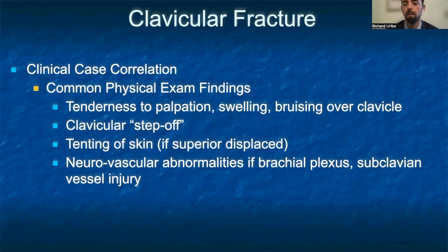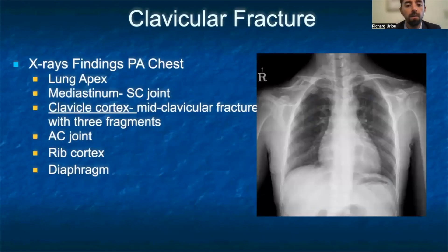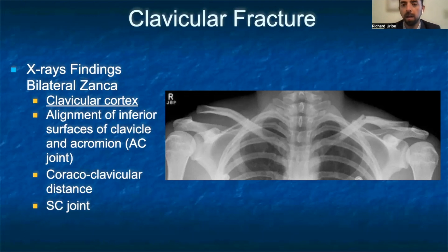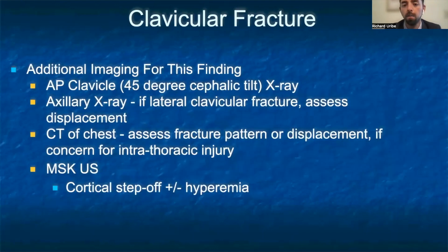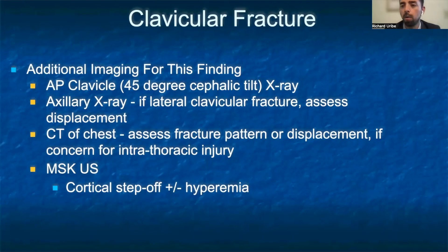If there is brachial plexus or subclavian injury, the patient may also have neurovascular abnormalities, including numbness, tingling, and skin changes. A clavicular fracture can often be noted on the PA view of the chest. On the x-ray to the right, we can see the right clavicle shows a mid-clavicular fracture with three fragments. The bilateral Zanca view may also be helpful, showing a displaced fracture of the left clavicle as well as an acromioclavicular sprain on the right. Additional imaging includes an AP 45-degree cephalic tilt film focused on the clavicle, an axillary view for lateral clavicular fractures with displacement, and CT of the chest if there is concern for intrathoracic injury. Musculoskeletal ultrasound is also useful to assess for any cortical step-off and hyperemia.